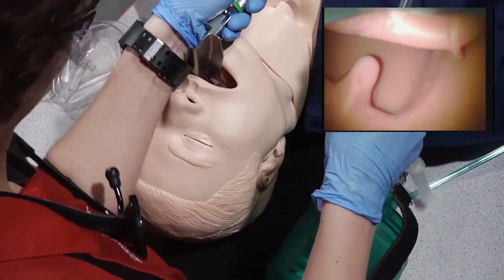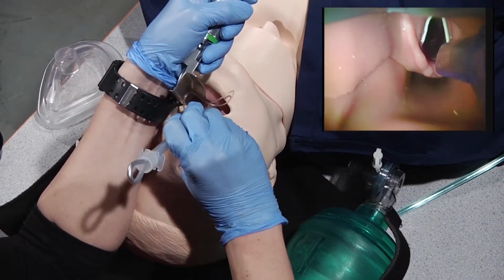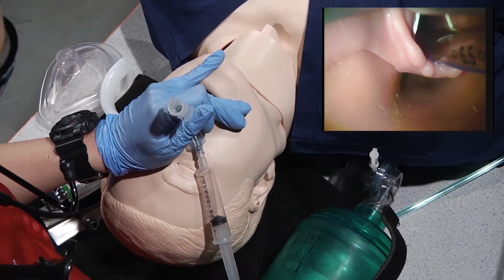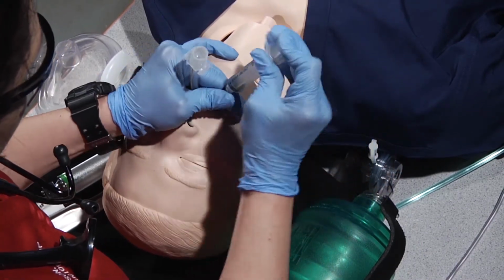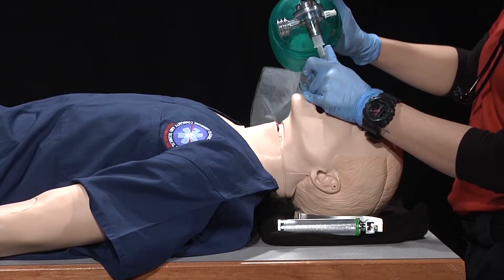Elevate the mandible with the blade and insert the ET tube to the appropriate depth. Once the ET tube is inserted, I'll remove the stylet, inflate the balloon to the proper volume, and immediately remove the syringe. Attach the BVM.